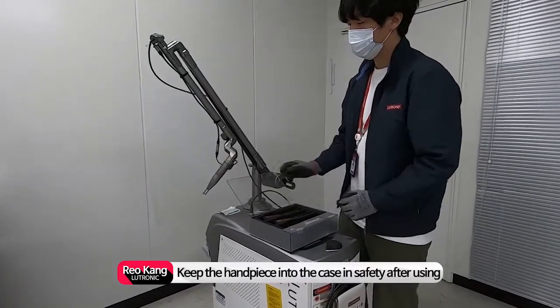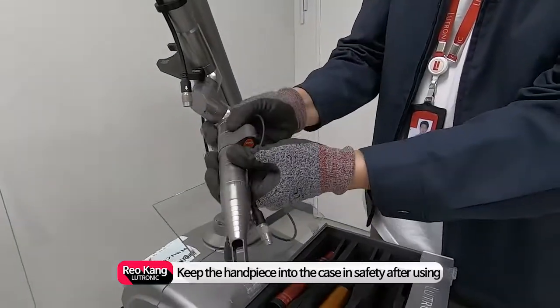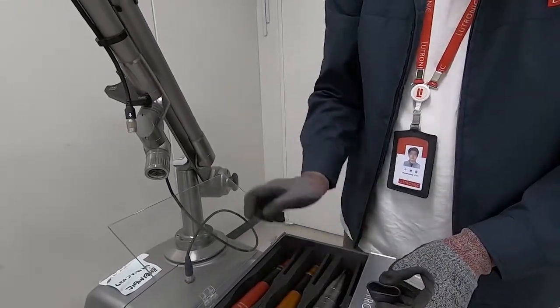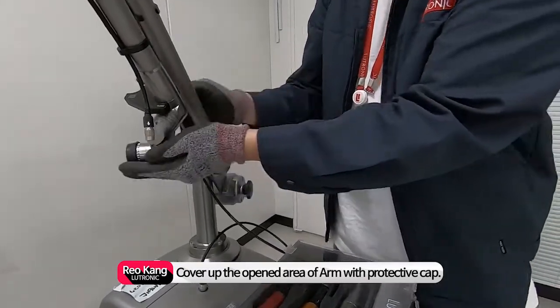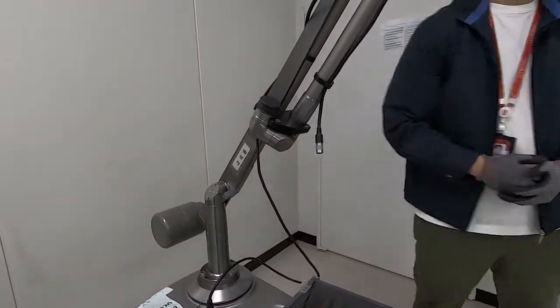Keep the handpiece in its case safely after using it. Cover the opened area of the arm with a protective cap to protect against dust flowing into the arm, then store the handpiece into the arm.